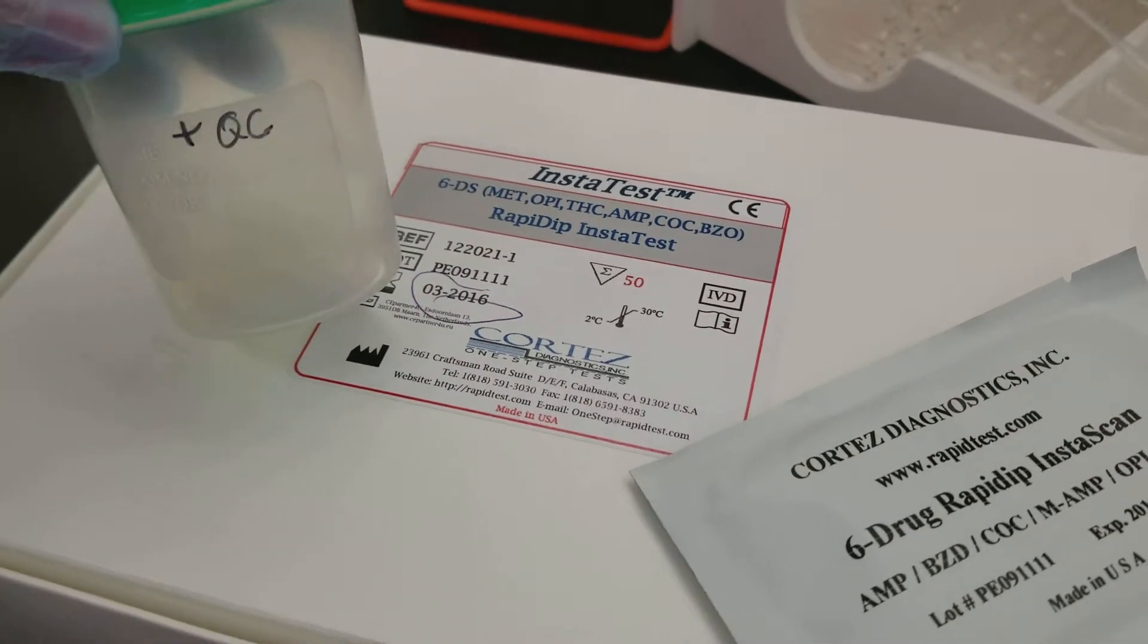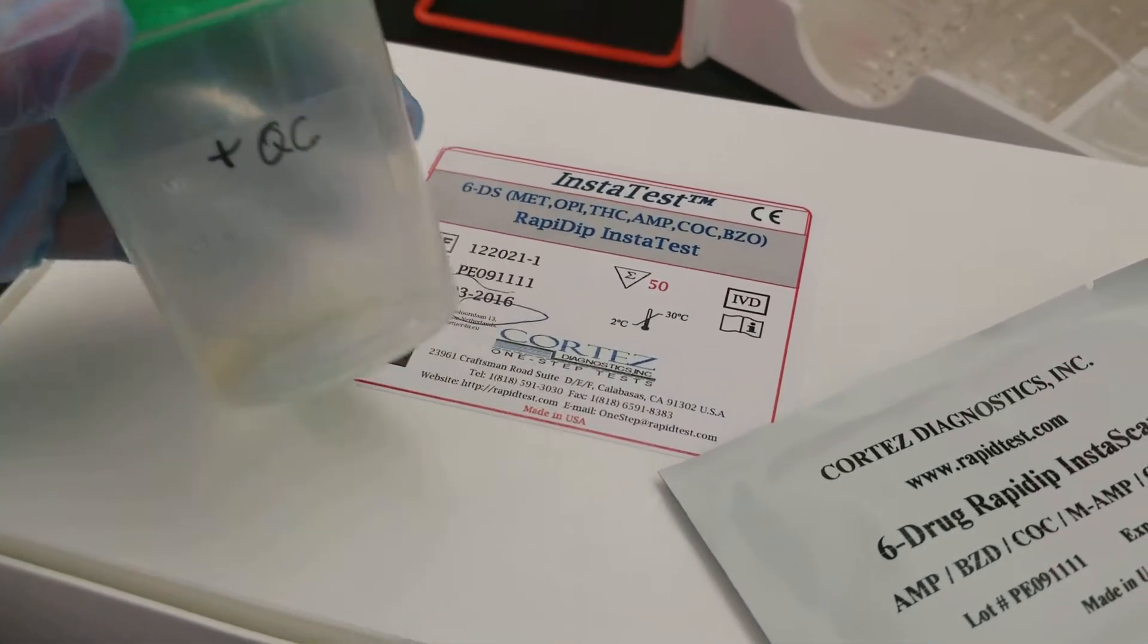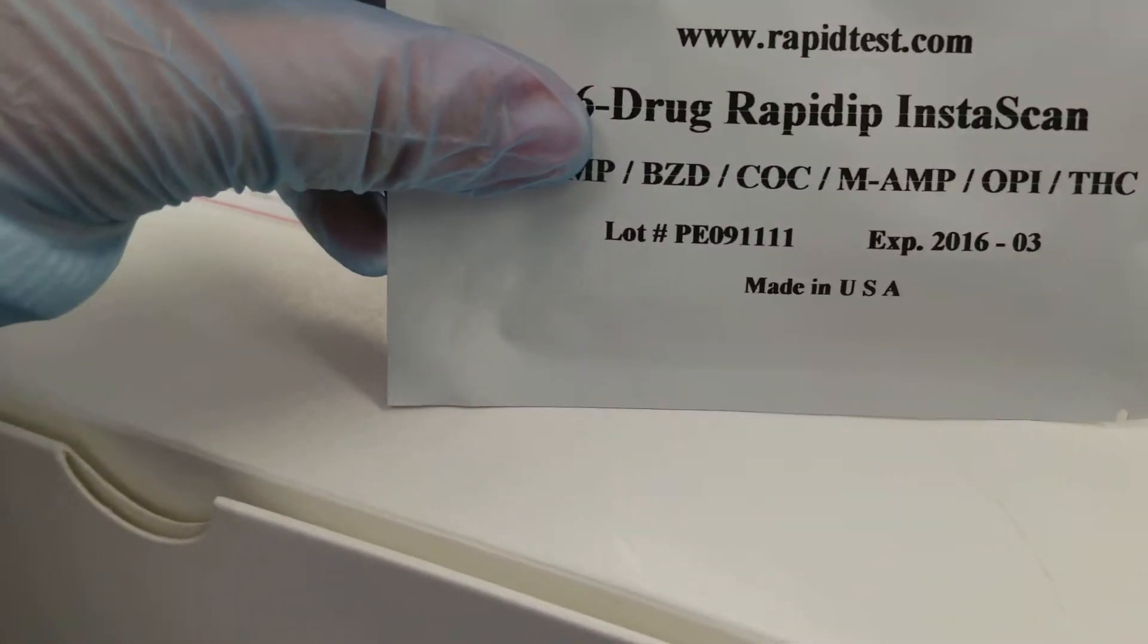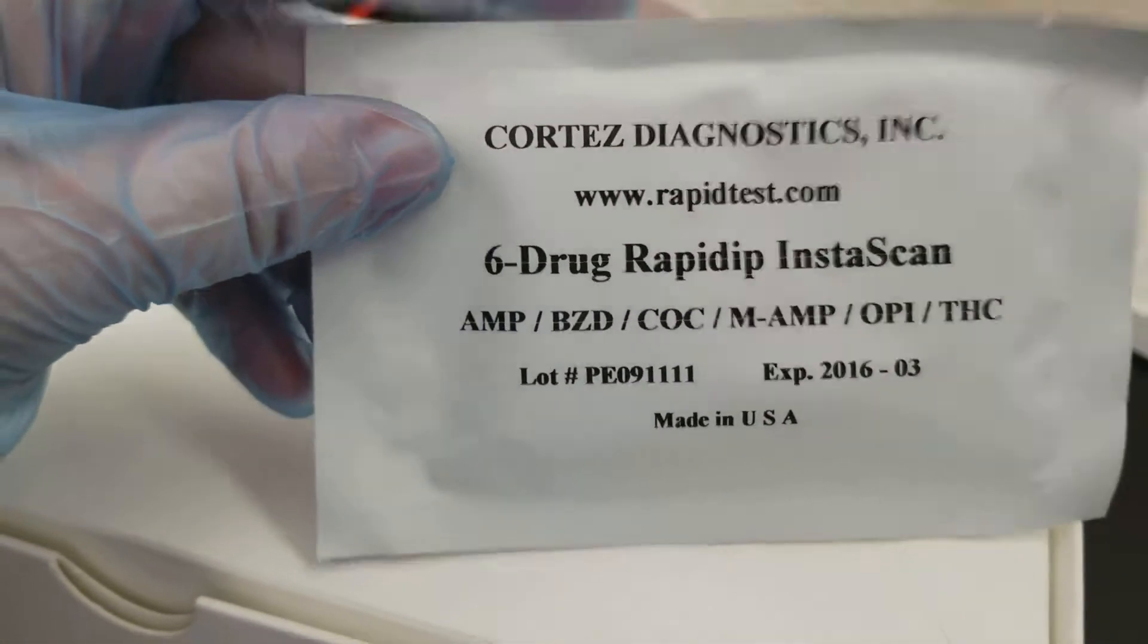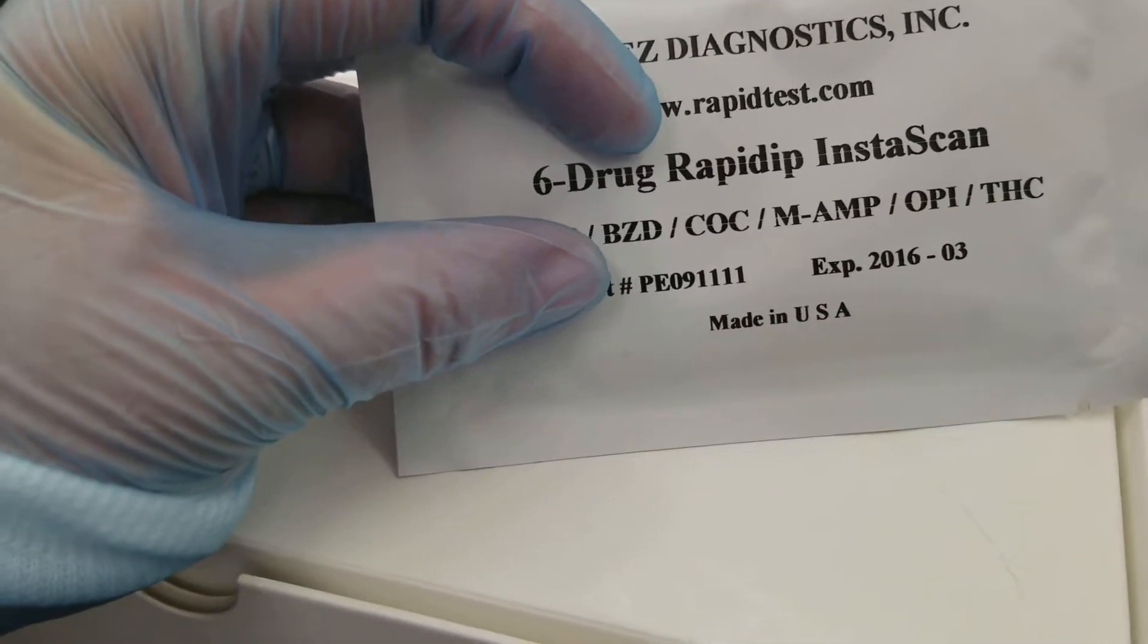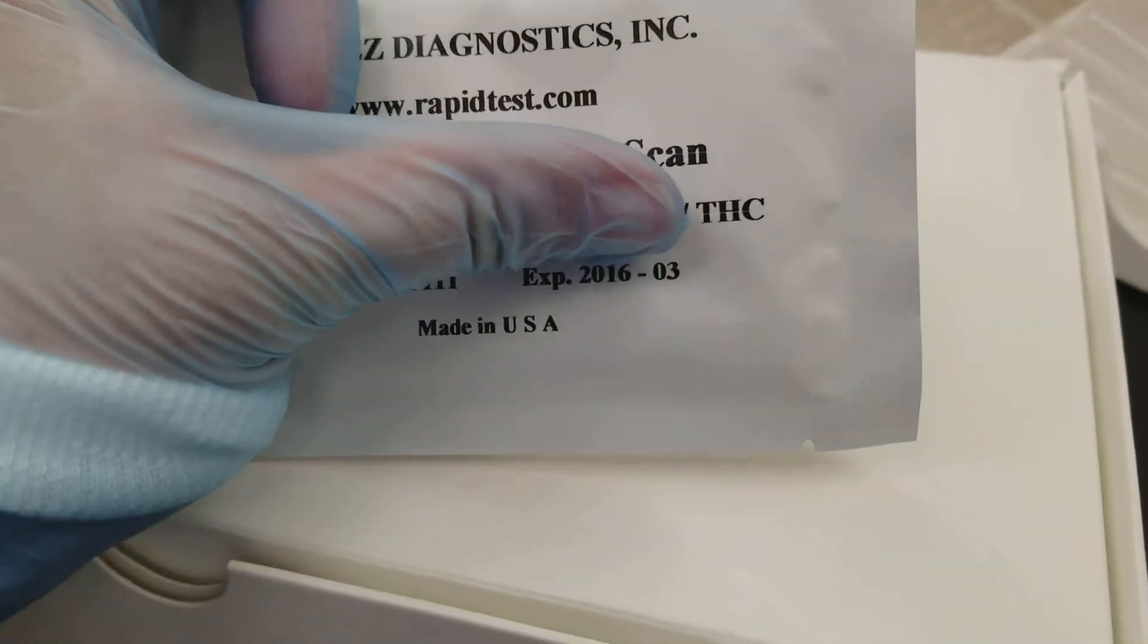So I'm going to be using the positive QC because I want you to see what it looks like. It's a rapid card that tests a patient's urine for amphetamines, benzodiazepine, cocaine, methamphetamines, opiates, and THC, which is a metabolite of marijuana.